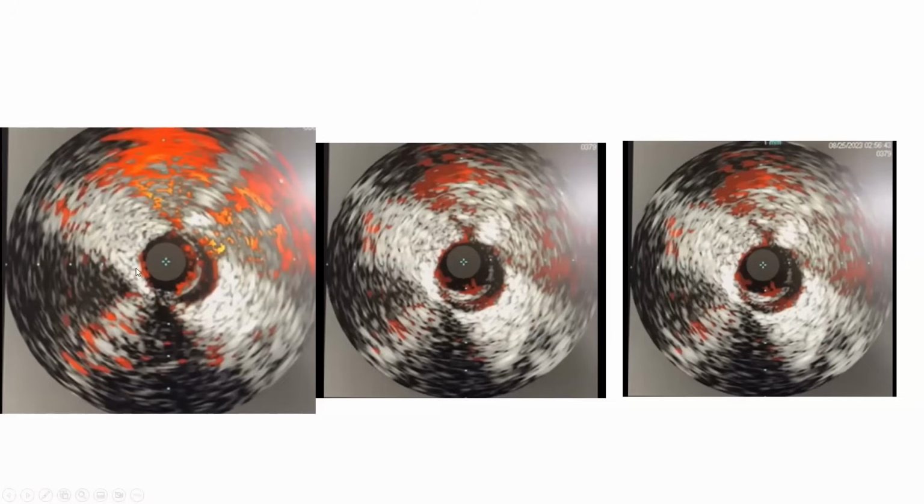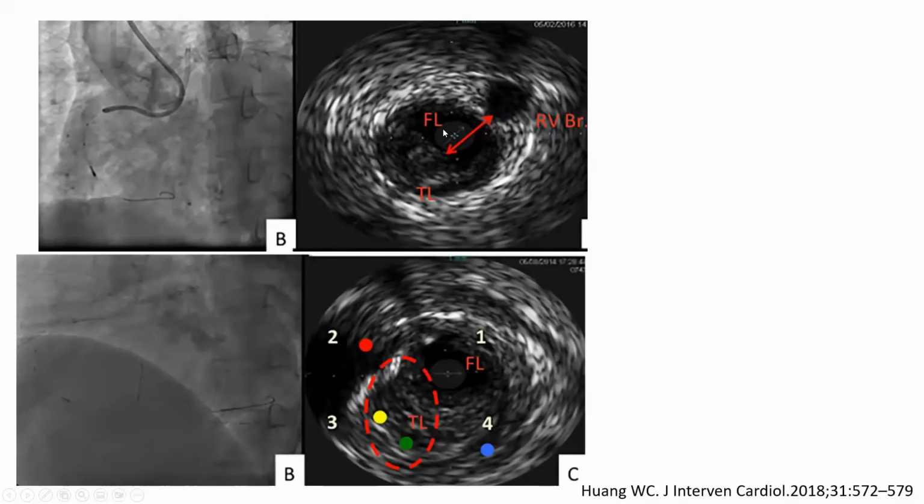You will be on this side with a collapsed white atheroma. These are images of CTO subintimal crossing. Here, the wire went subintimally, and the IVUS is over that wire. So the IVUS is in the false lumen, FL, and the true lumen is that white compressed intima atheroma.